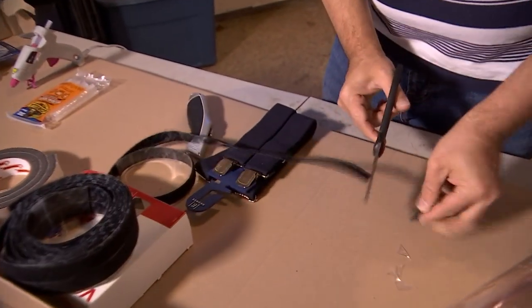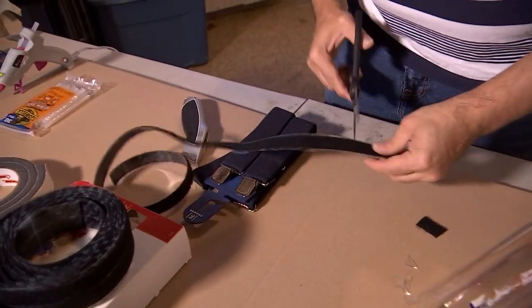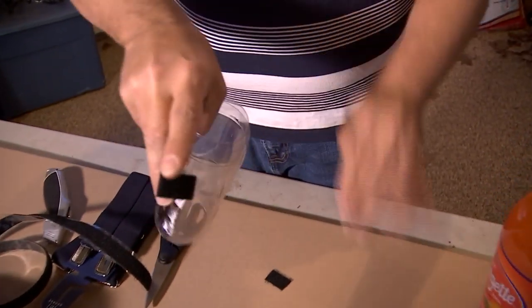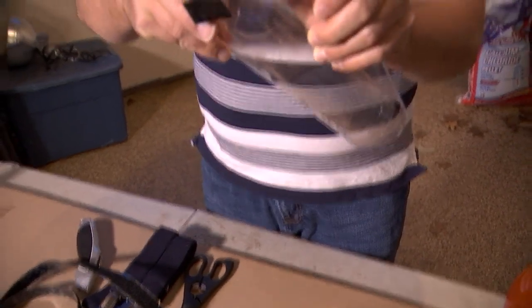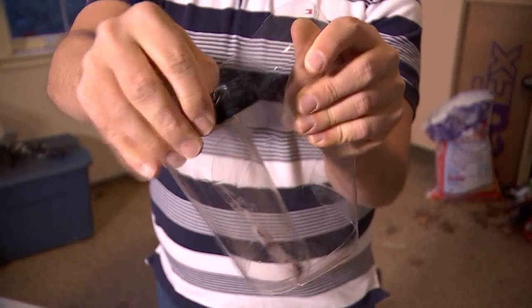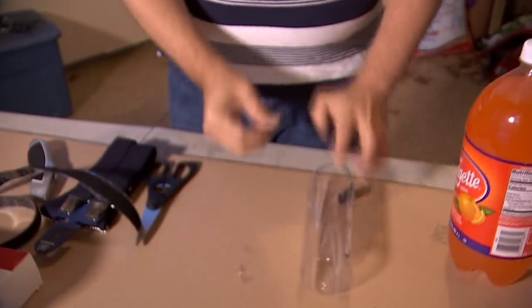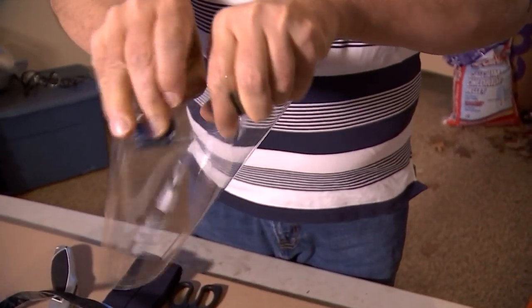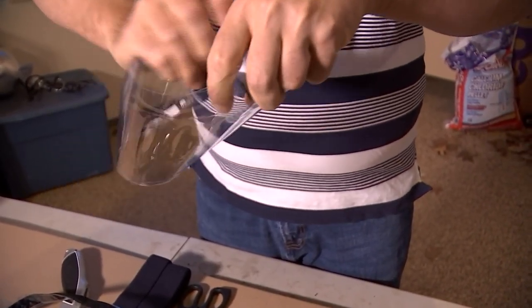To finish the mask, take the soft part of Velcro tape and cut two small pieces. These are self-adhering, so on the top of the mask — the part of the bottle that's rounded in — place them about five inches in from the outside and about an inch down on each side. Once you get your headband done, it's going to stick right to it.